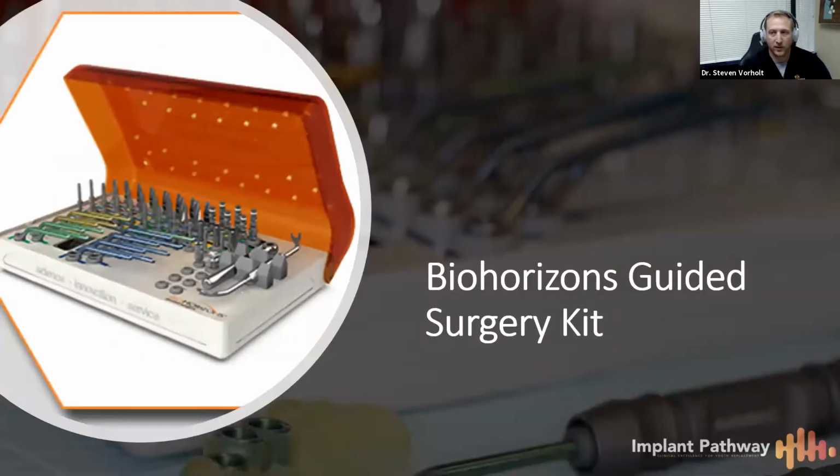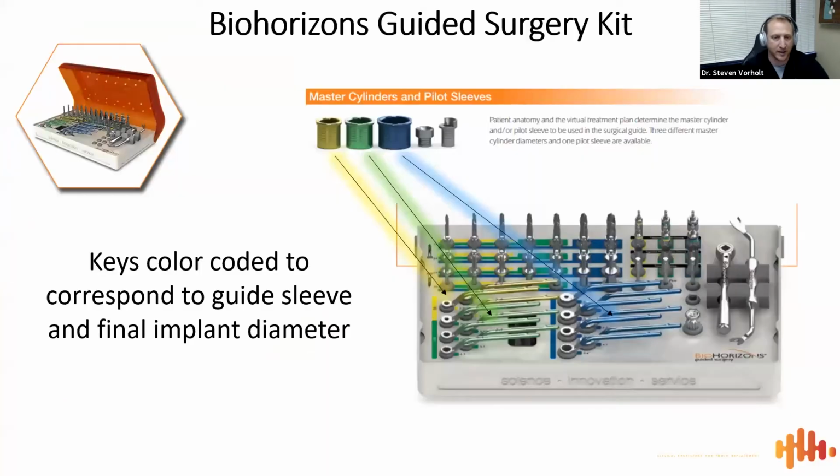So quickly, we're going to go through the BioHorizons Guided Surgery Kit, because if you're not familiar with it, the pictures later might not make a lot of sense. But essentially, the BioHorizons Guided Surgery Kit is a keyed kit, which means there are master guide sleeves that are a certain diameter, say 6 millimeters. And we have these keys that you see the arrows pointing to that will reduce that diameter down to the diameter of whatever drill you're currently using.